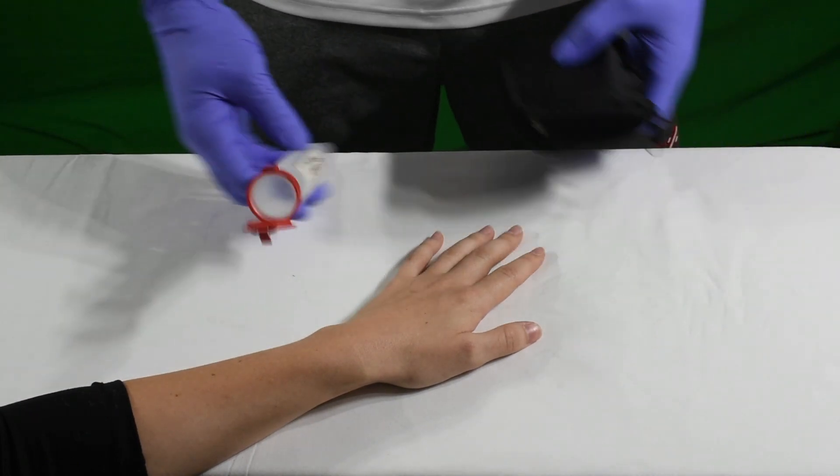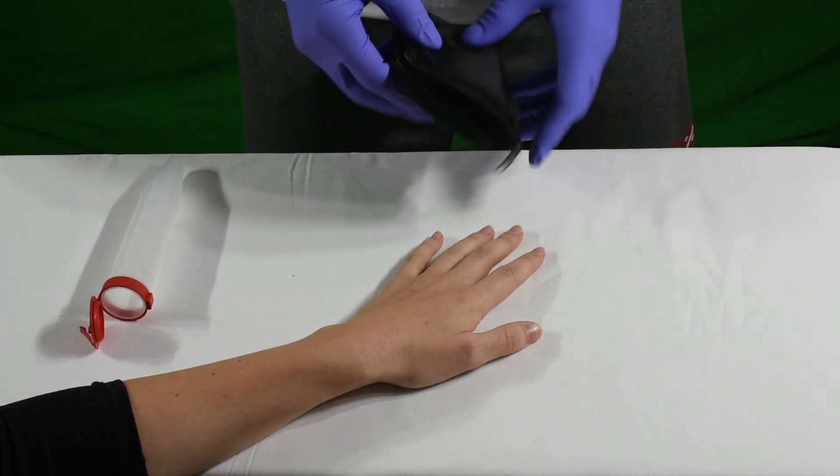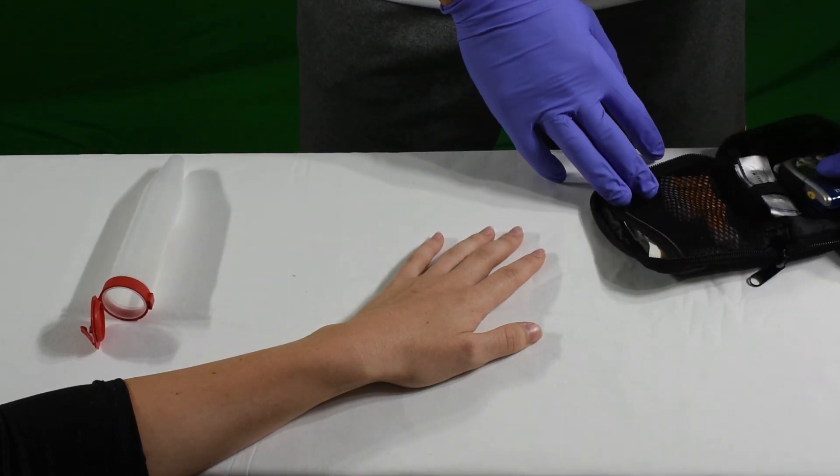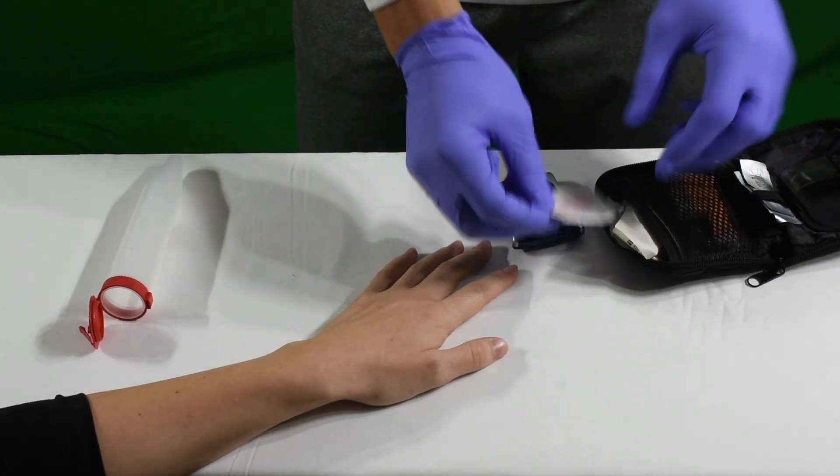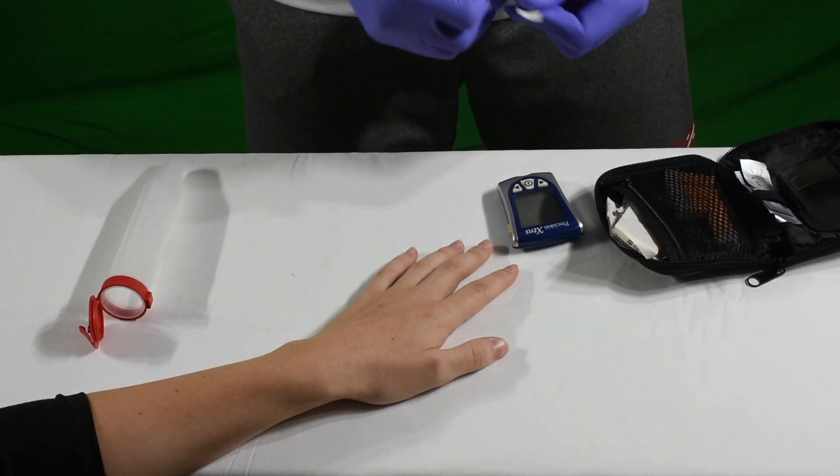What you want to do is gather your gear. You want to get a sharps shuttle, open up your equipment, take out the monitor, take out an alcohol prep, and get it ready to go.